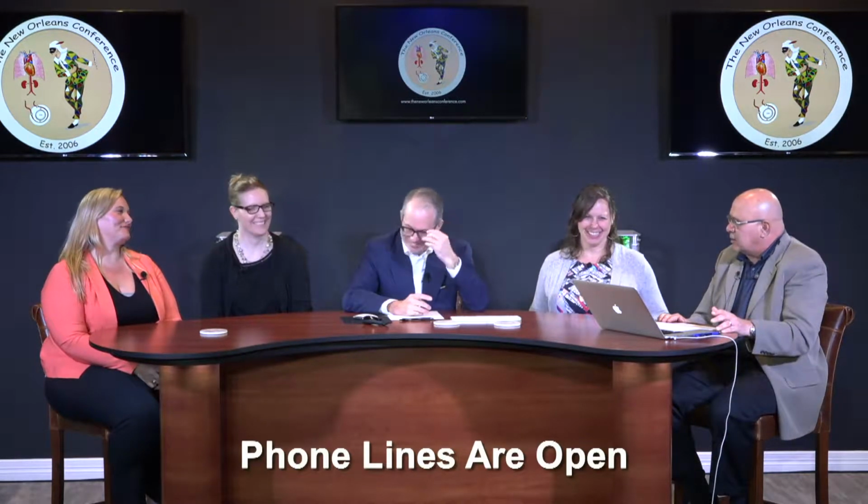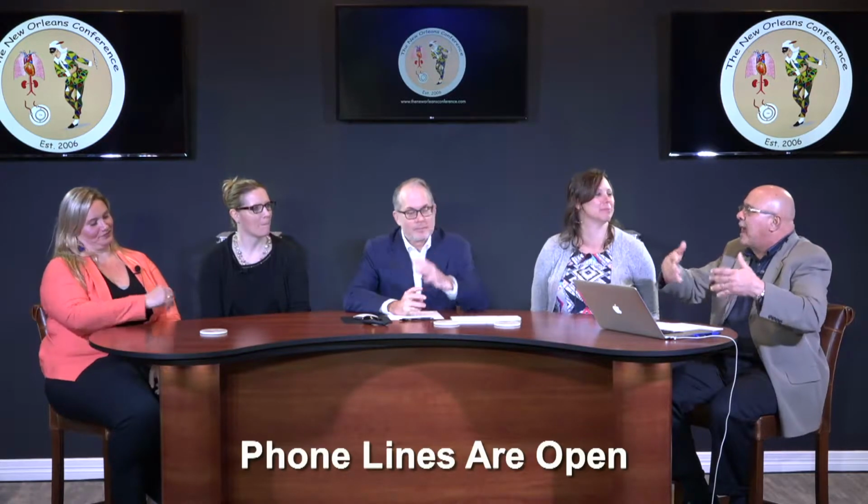nurse ECMO specialists. Perfusionists automatically, just by what our training is and our certification through the American Board, we can manage ECMO. That's just part of what we normally do. The nurse ECMO specialist, really any nurse, can manage ECMO. They don't have to be a nurse ECMO specialist. But in the big wide world out there, there exist both nurse ECMO specialists and respiratory therapy ECMO specialists.